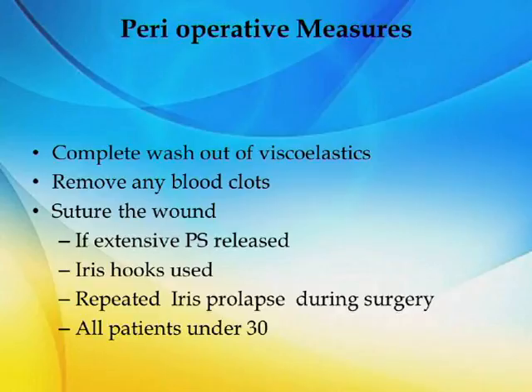Suture the wound if extensive posterior synechial release was done, if iris hooks were used, and if there is repeated iris prolapse during surgery. Usually they are all younger patients under the age of 30. So in all these patients, you have to do wound suturing.